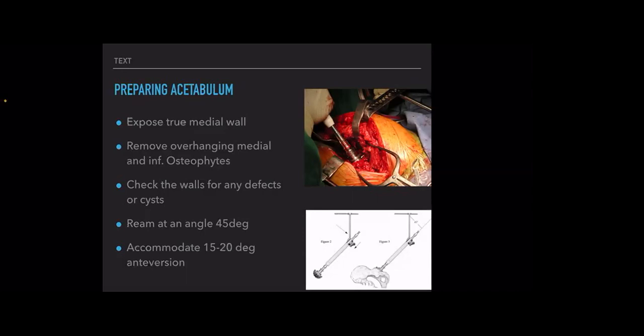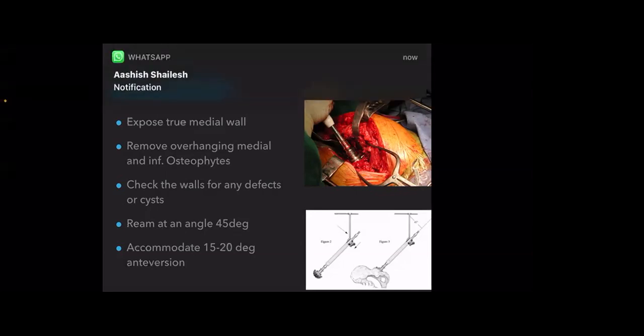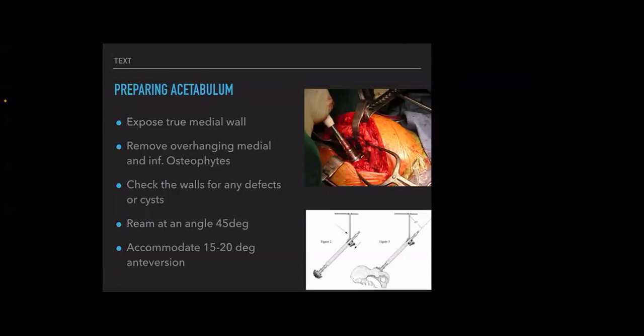Always keep checking the position and angle of the reamer, so that you are reaming in the right direction. And always keep checking with your mops so that you are not going to breach the medial wall. As I told you, the floor, which you can mark with a cautery or something, should always be in your mind while you are going towards the final reaming. You also have jigs to check that you are in the right anteversion. Almost all the companies provide that; you only have to ask for it. You can check it once or twice on the particular reamer, so that you have a three-dimensional orientation of the direction of the reamer.